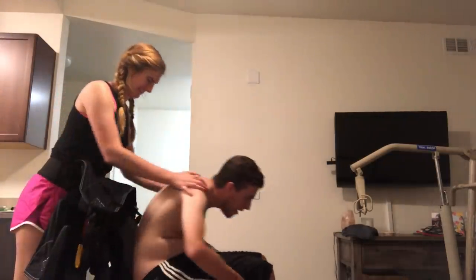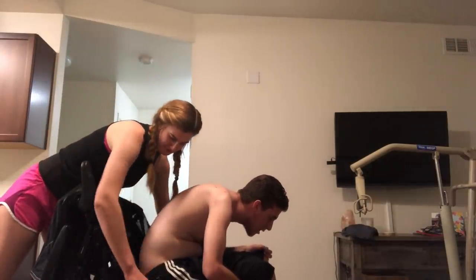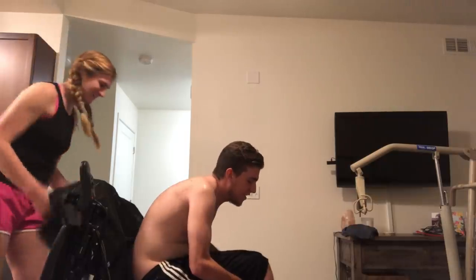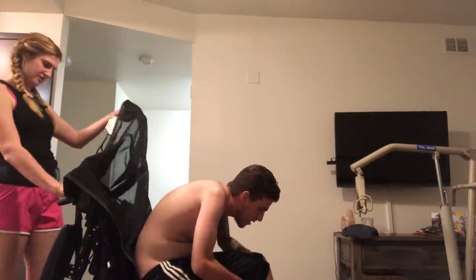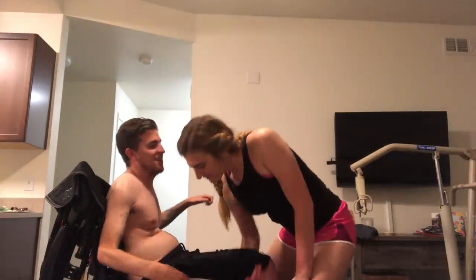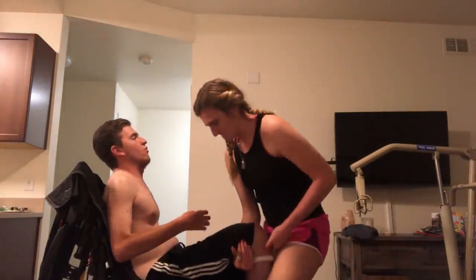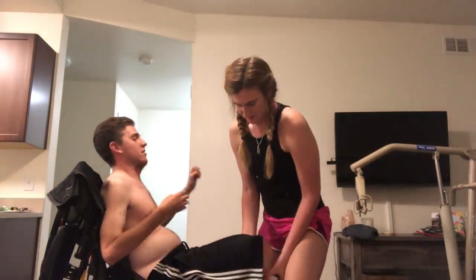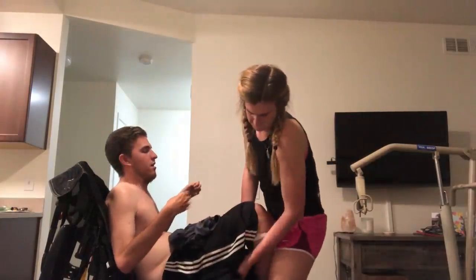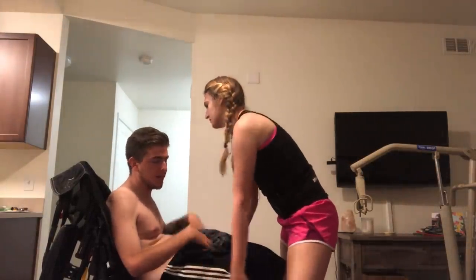I don't want you to fall out of your chair. Bri is sliding it behind his back and then making sure there's a lot of extra slack. Then comes the fun part — she lifts up the leg. Pull that side through. This is saving my back a lot more. Pull that through — perfect. I can feel my butt in that hole, and usually when I can feel it, that means I'm nice and centered.